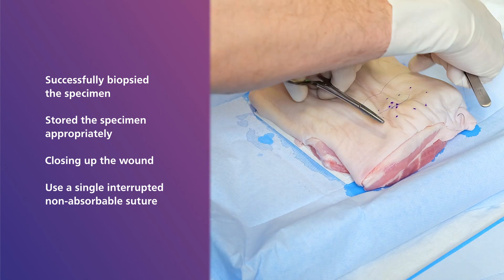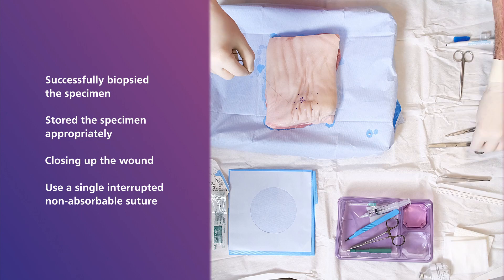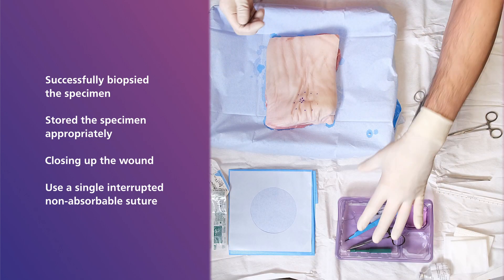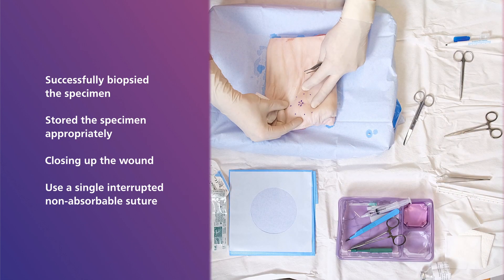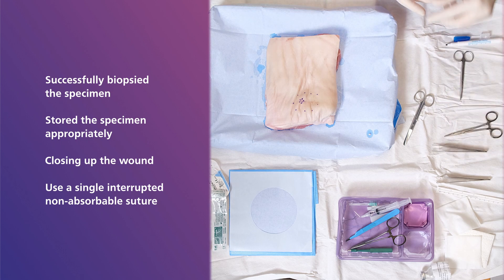This process can take a little time, so what you are seeing now is a sped up version. Once you have successfully sutured the wound, apply the appropriate dressing and provide aftercare for the patient.